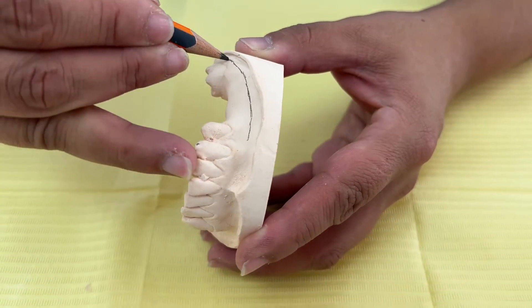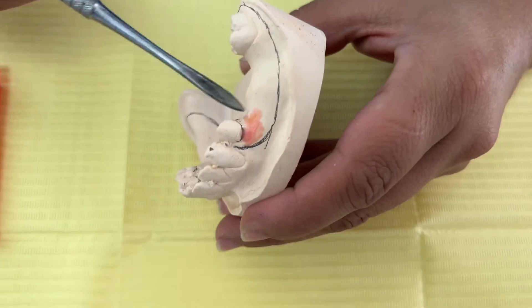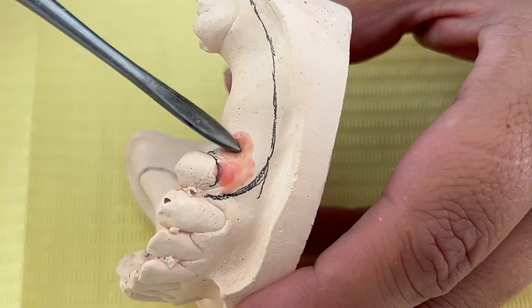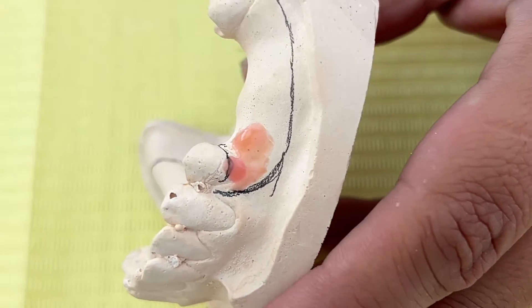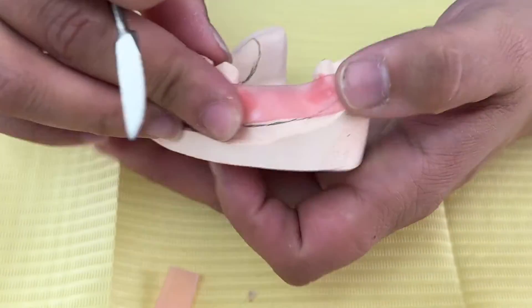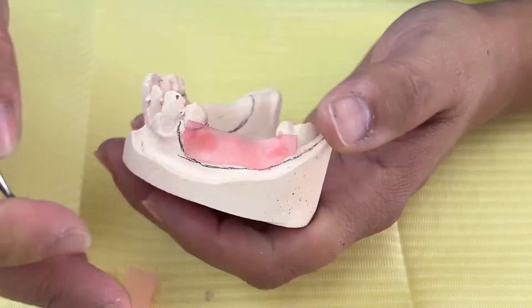Mark up your model and design your prosthesis with perfection in mind. Carry out all alignments using a dental parallelometer if possible and block out the oral vestibule with wax. The wax-up of the oral vestibule is important. Aim for a thickness of 0.5 or 0.6 millimeters.